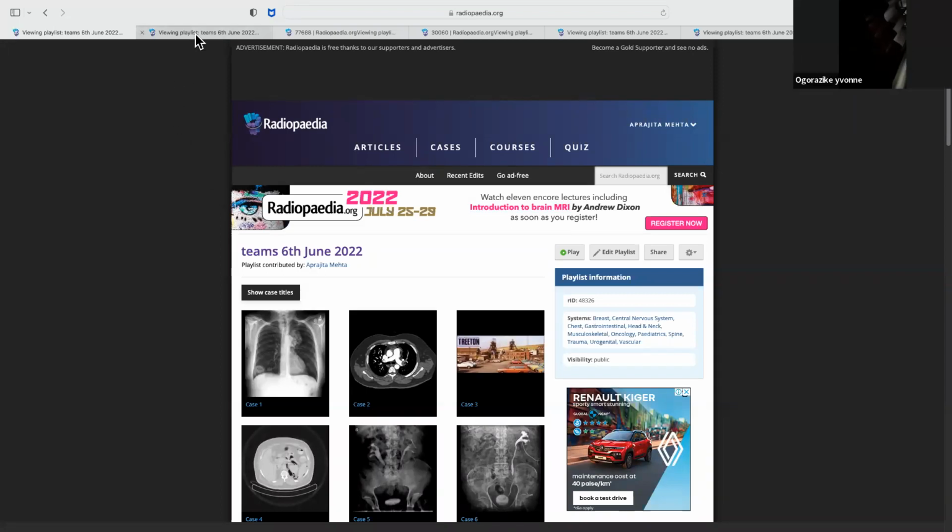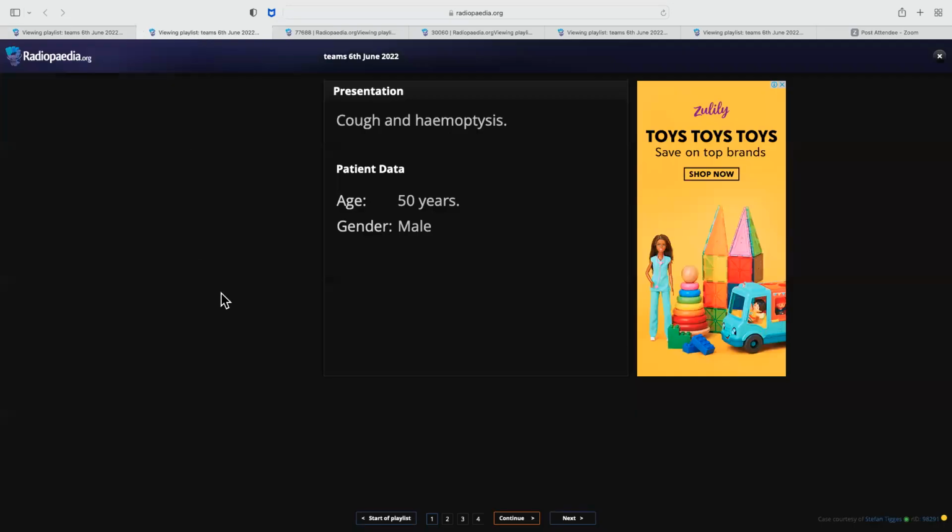Okay, Dr. Mehta, you can start now. Yeah. So, Dr. Samir, that's your first case. You will keep the control or I'll keep? No problem, I can request it. Okay. So, whenever there's CT or MR, maybe you can request it.